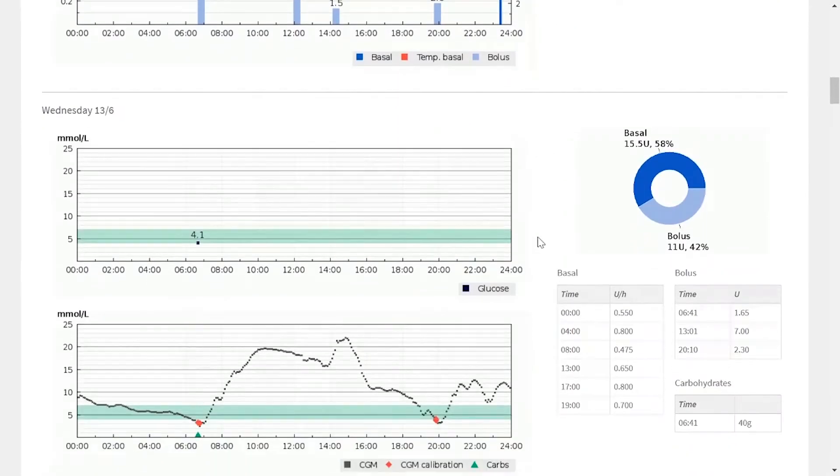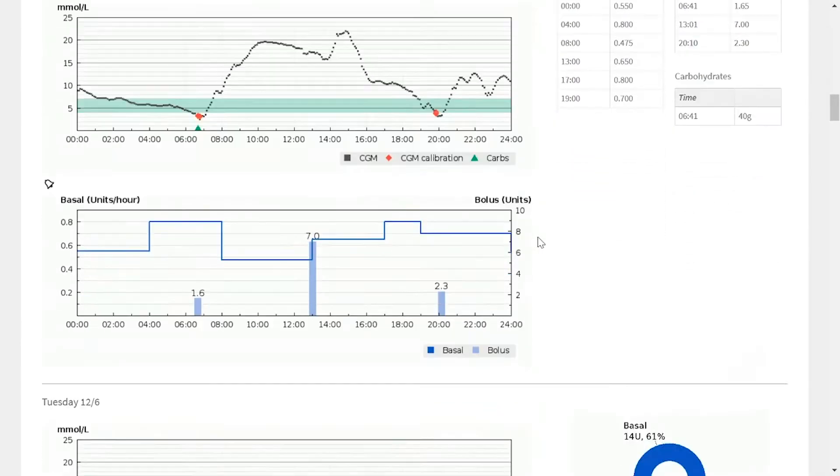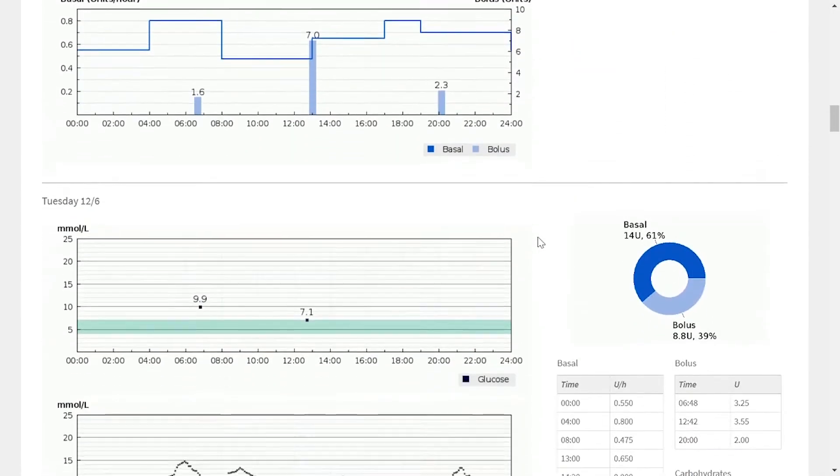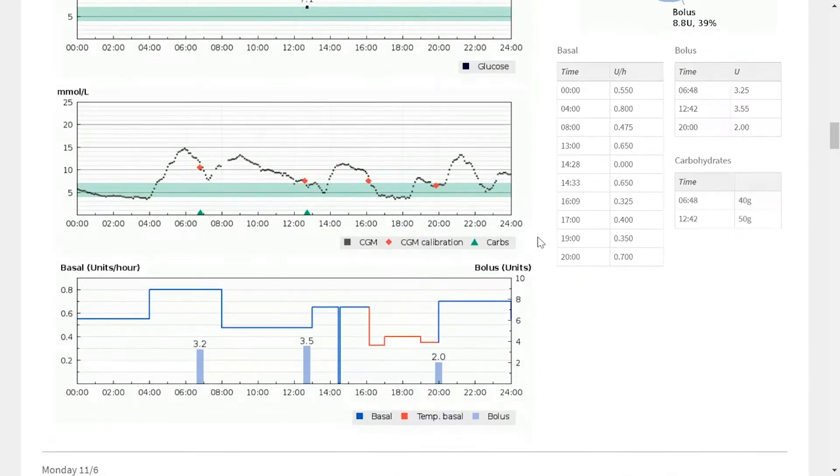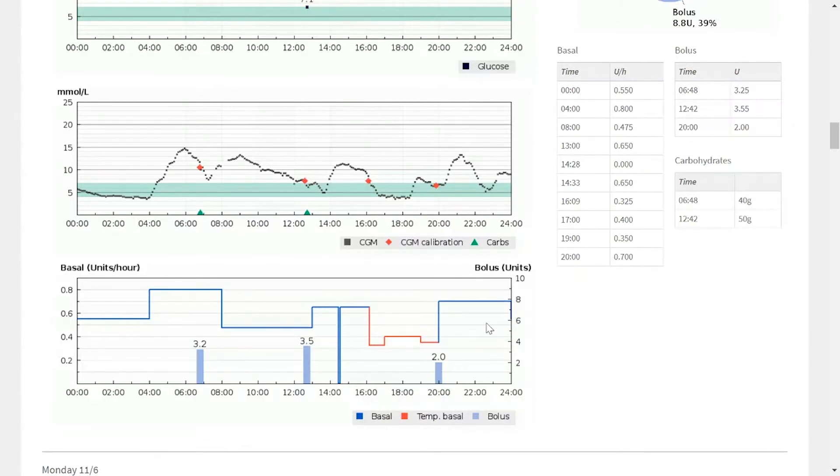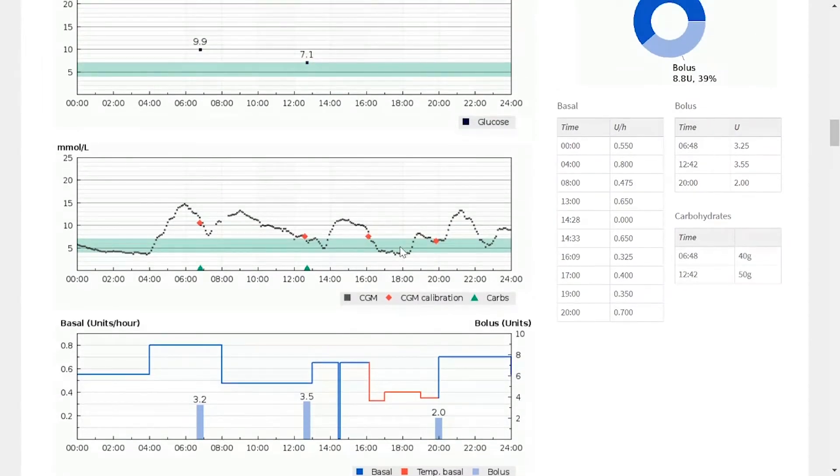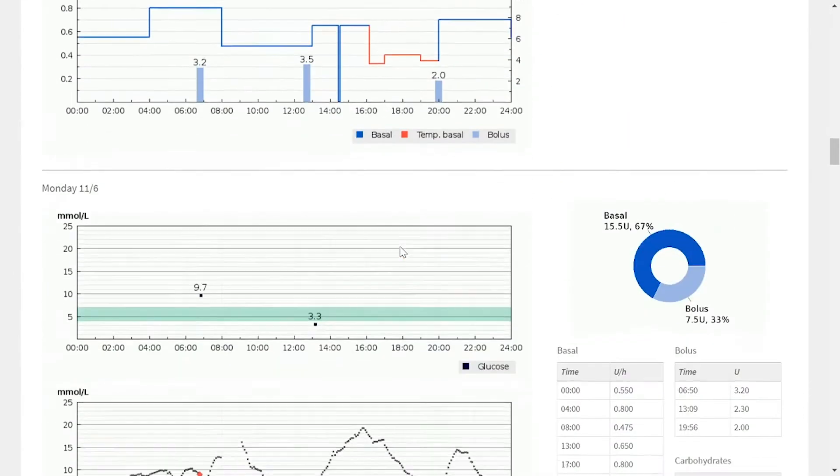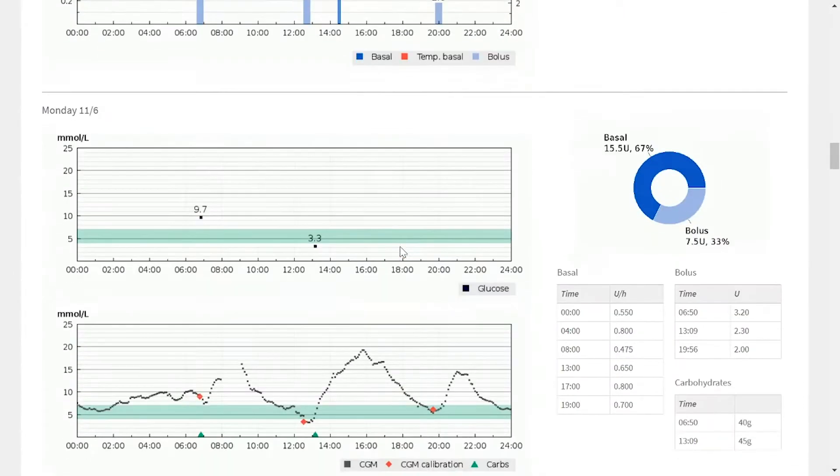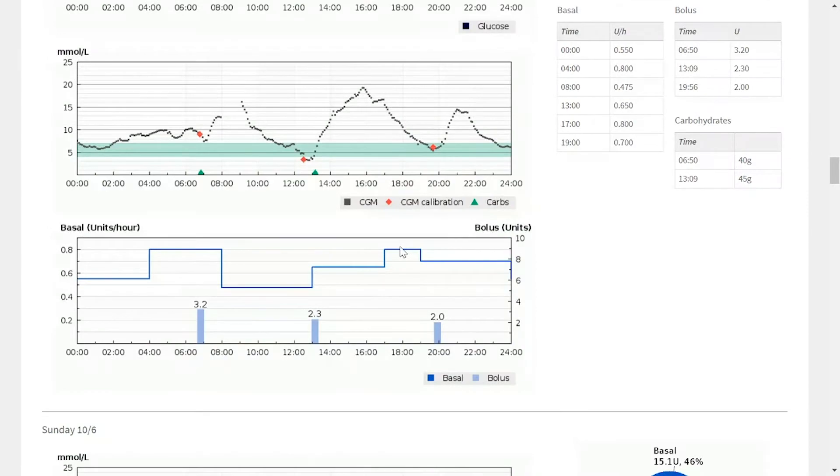As we scroll down, you'll see how the same information appears for various different days. This can be useful if you're looking at a specific basal profile, and you think it's impacting blood glucose in a certain way. And you can see if that's the case for every day, or just particular days of the week.